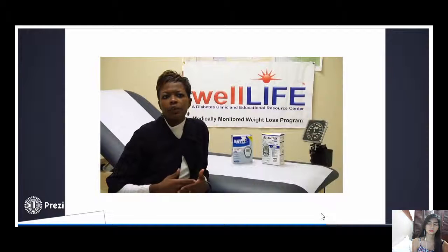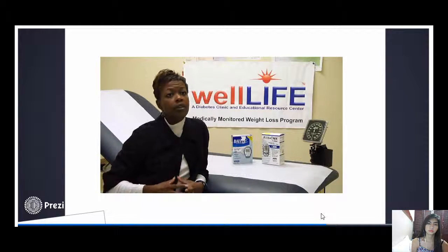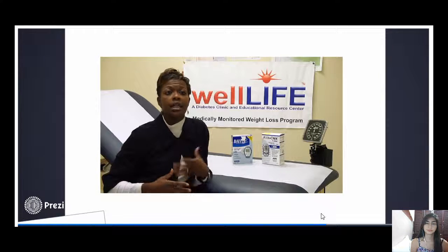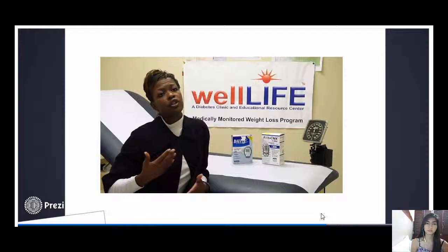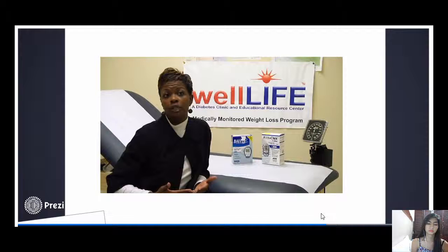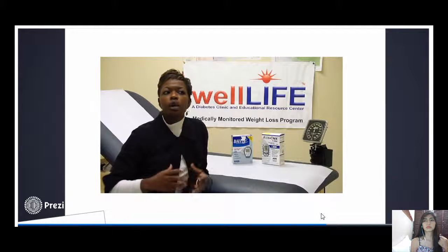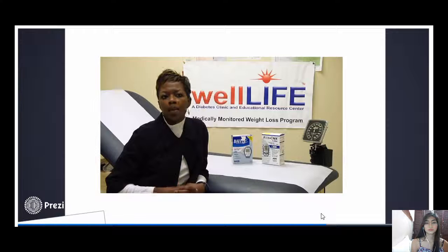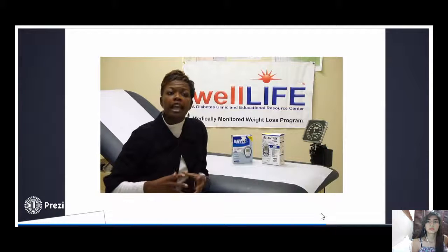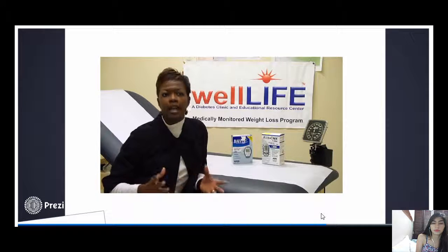Now during meal times, we know that the blood sugar is going to peak, the blood sugar is going to go up, and that's with everybody. So they are able to go into their pump. They're able to tell the pump, I am eating 60 grams of carbs and my blood sugar is 180, and the pump will relay a number to them which suggests this is how much the pump wants to give them in order to bring the blood sugar down. And so it's a really proactive way of lowering the blood sugar. So it really helps to maintain a healthy blood sugar throughout the day.